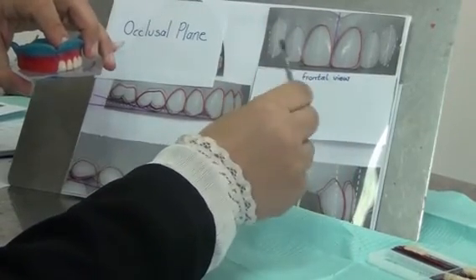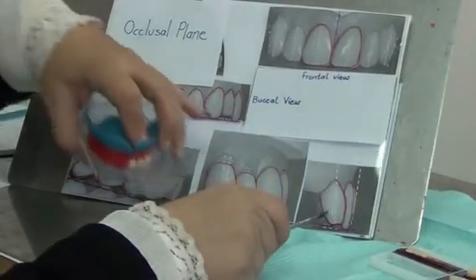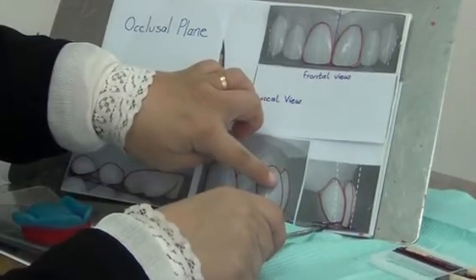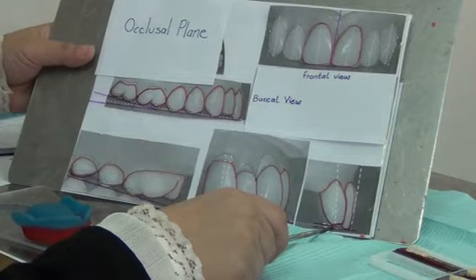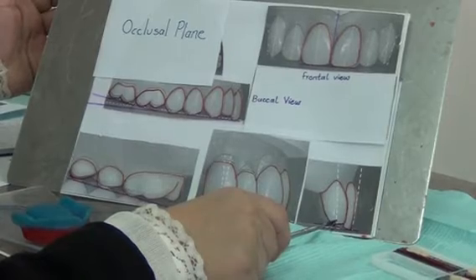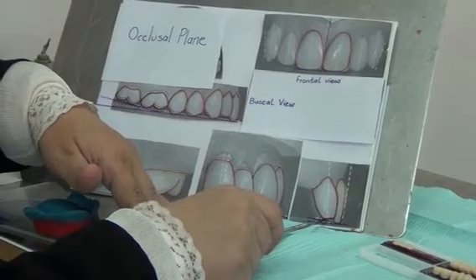So when I'm going to correct your work, I'm going to say centrals should be touching, laterals should be a bit higher. You can notice that the lateral is not touching the glass slab, it's higher by 0.5 to 1 millimeter.